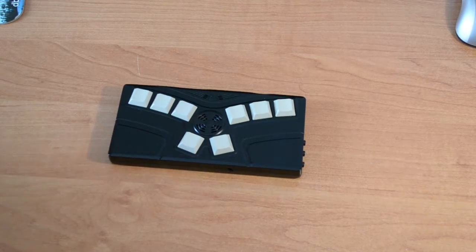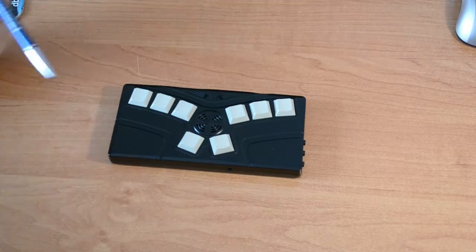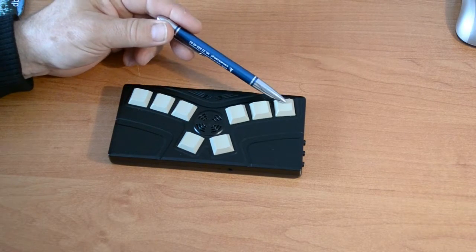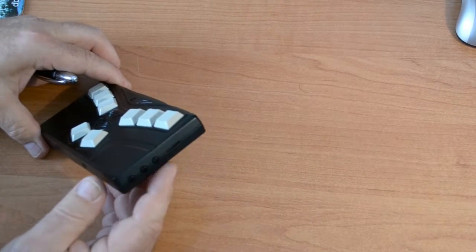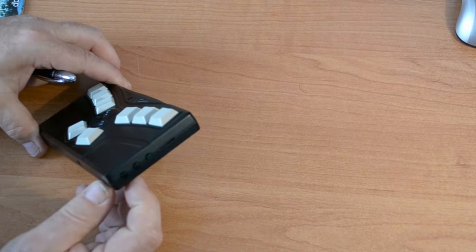This device, even if it is very advanced, doesn't have many keys. The keyboard is very simple. It has only 8 keys representing the braille dots. So this is dot 1, dot 2, dot 3, dot 4, dot 5, dot 6, dot 7 and dot 8. It has also additional 3 buttons which we use to control the audio or to control internal functions.